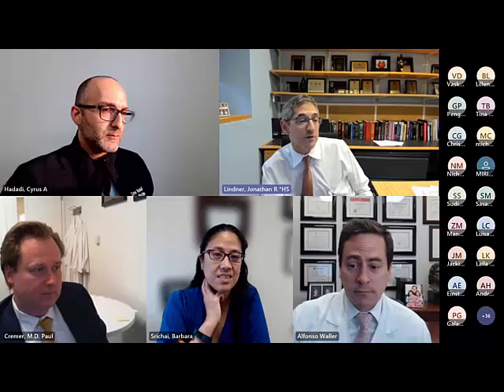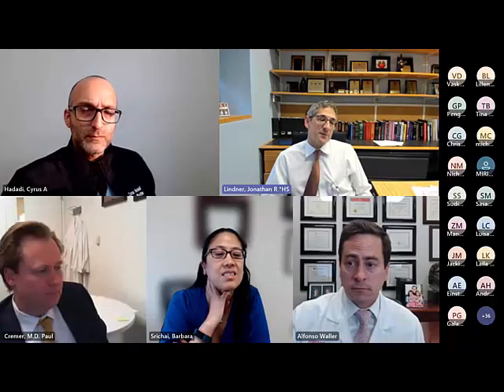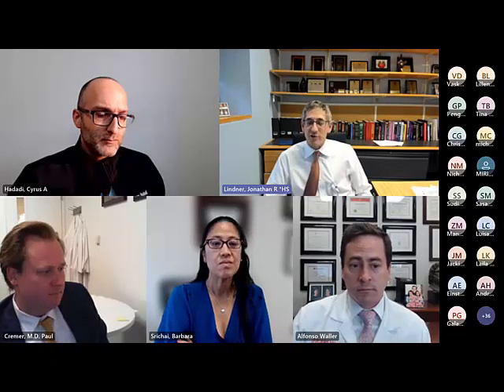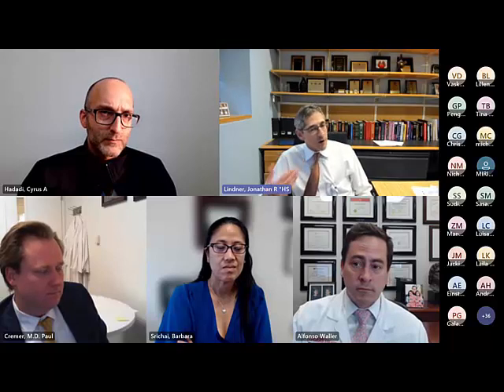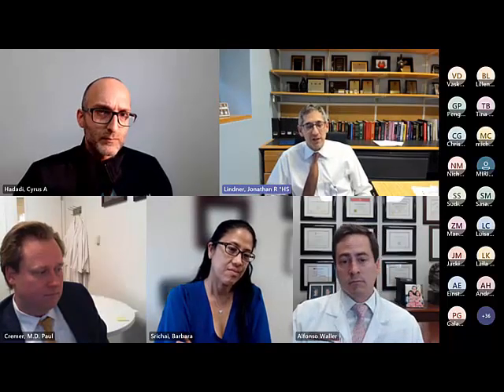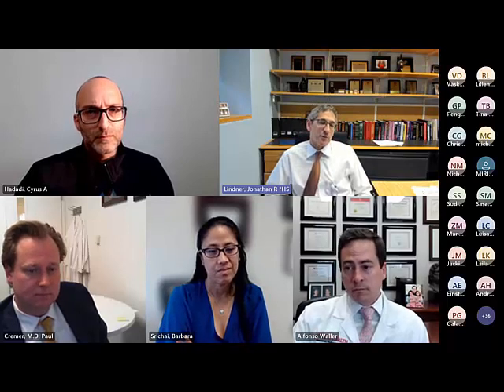We haven't talked much about echo, but I will say one thing, which is both the presentation that Paul showed as well as yours, Cyrus. It's really important when you're doing TEE to be knowledgeable about some atypical imaging planes and approaches. Paul showed a beautiful example of how you can get way up on the SVC and even over to the brachiocephalic vein on some people who have indwelling devices for RV leads. Going to a transgastric view, going to about 110 degrees and turning over to the RV for a beautiful long axis of the RV can be helpful for looking at not just the location, but the spatial extent of lesions, which sometimes helps differentiate vegetation from thrombus.